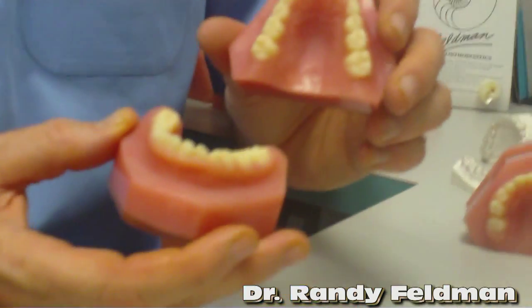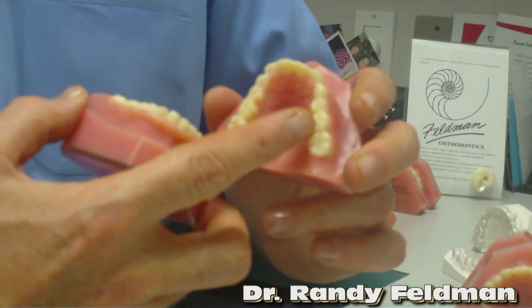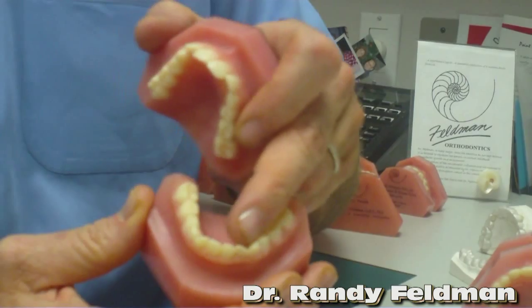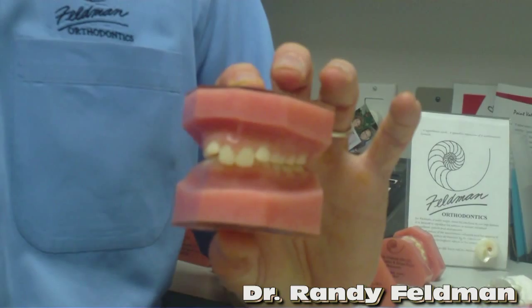When we see kids at an early age, we have to make a decision as to where they are from a functional and growth and development standpoint. This is how the child started in the very beginning: extremely narrow across the upper jaw, high arched palate, constricted arch, very crowded front teeth, same thing on the bottom. Very narrow, a lot of crowding, and when you put the teeth together, the bite is very deep and very narrow.